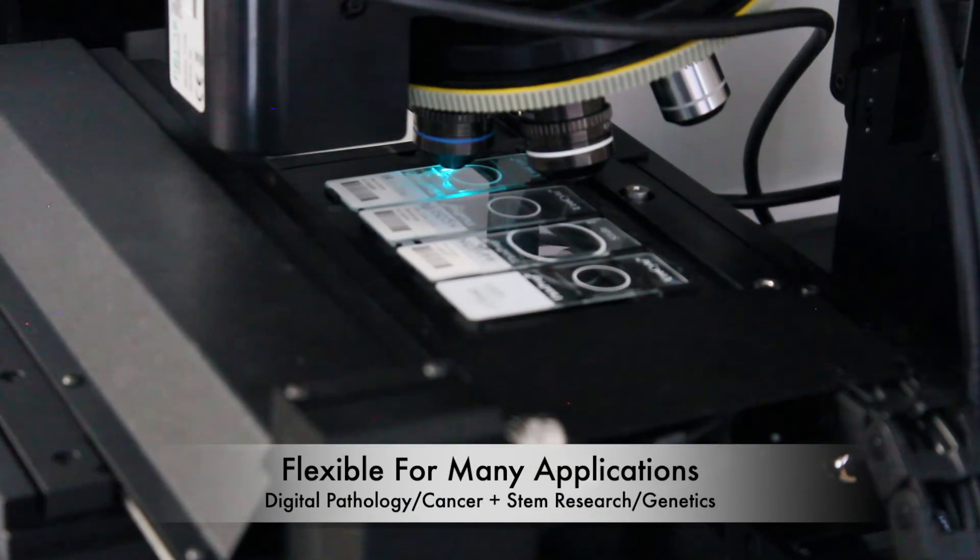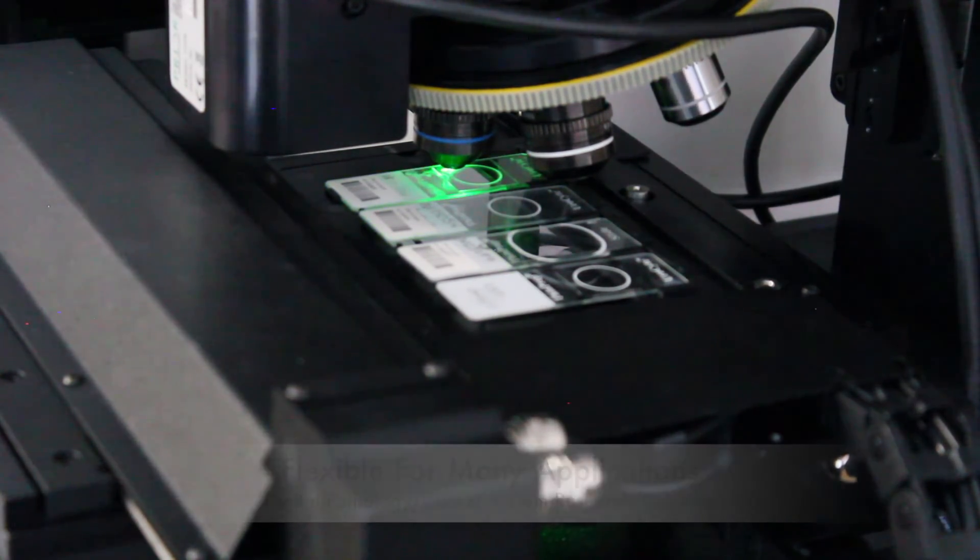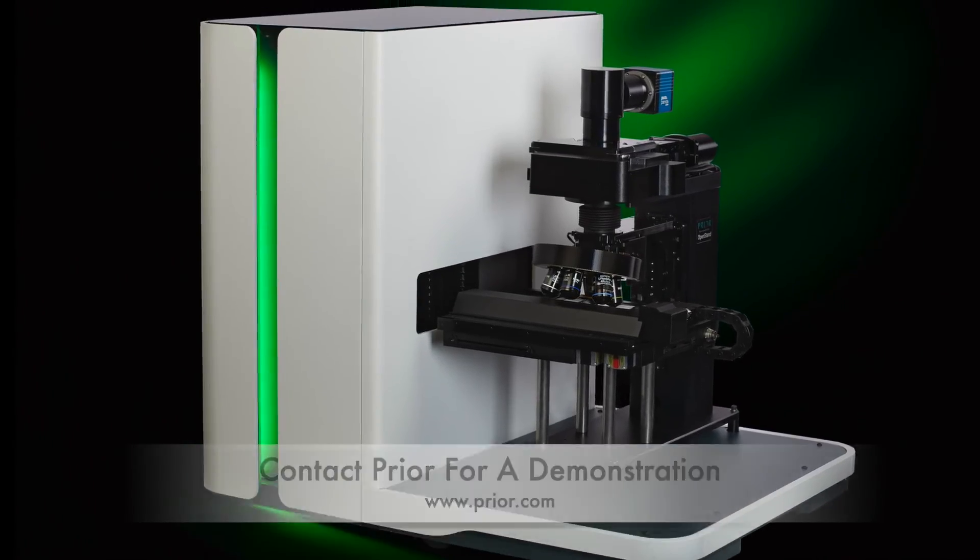It is the perfect system to build your applications for imaging high volumes of slides with precision and reliability. Contact us for a product demonstration.